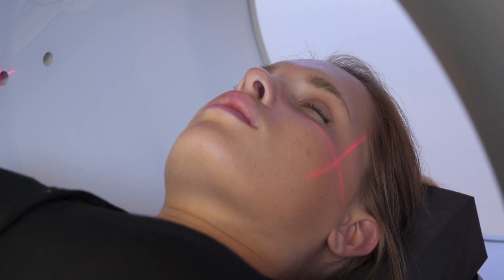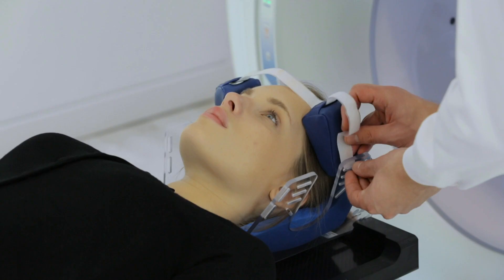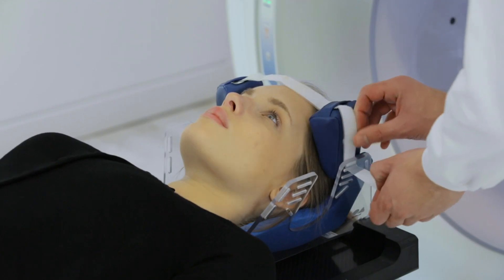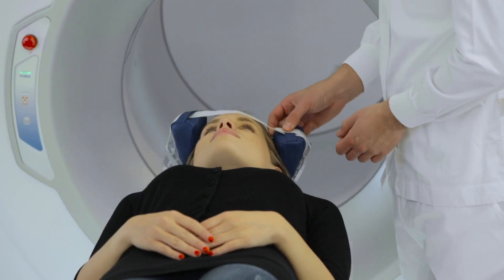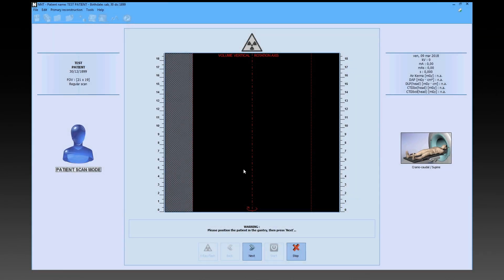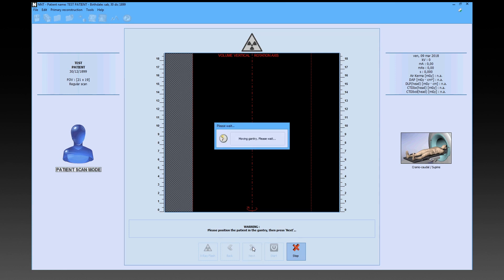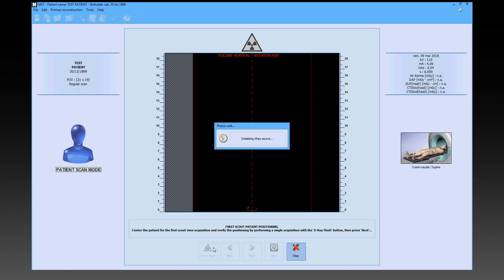If necessary, fix the anatomical part with the supplied fixing devices. After going back to the console, the physician hits Next and, using the X-ray flash button, obtains the first scout image.